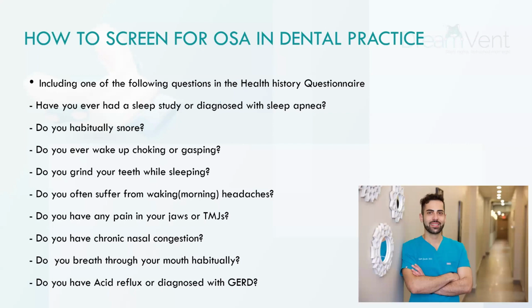Good. Yes, wonderful. Thank you, Dr. Sharma, for a beautiful presentation, and appreciate the time. As Dr. Sharma was mentioning, as dentists, we have the best position to screen for sleep apnea. A lot of the patients that come to our practice, we're always looking at their airway, their jaw, and the type of wear pattern on their teeth. All of this can be indicative of some form of sleep disordered breathing that can manifest also in the mouth. And if we can send them for the proper diagnosis and testing, it's going to help their overall health. And if we can make an oral appliance in the meantime, we can also do our part on the dentistry side.